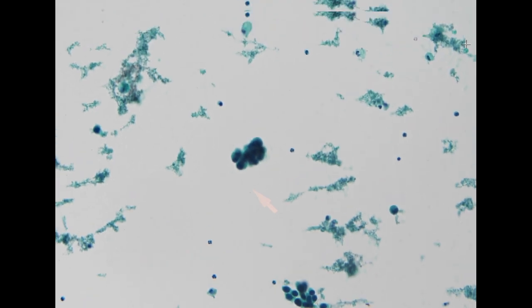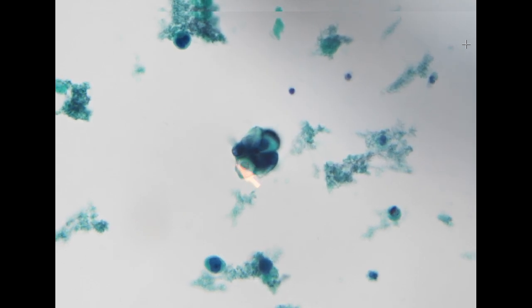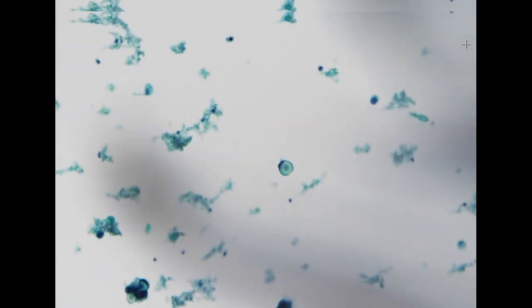So we have some background material, and we have some pretty tight clusters of cells. Additionally, there is one more uncommon feature: they have some signet-ring type of cellular morphology, which is kind of uncommon here again.